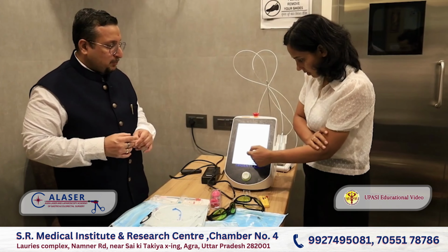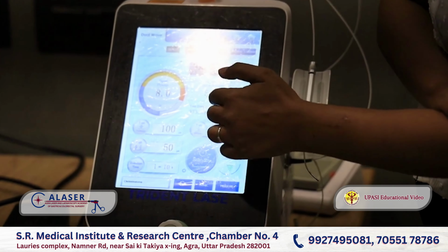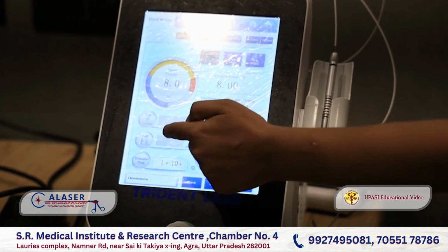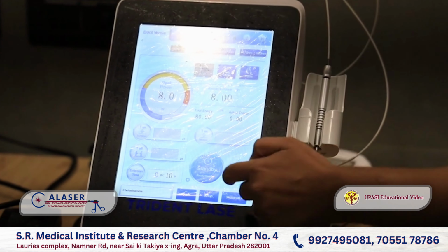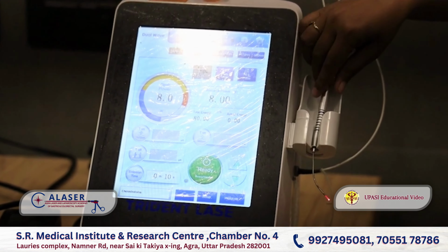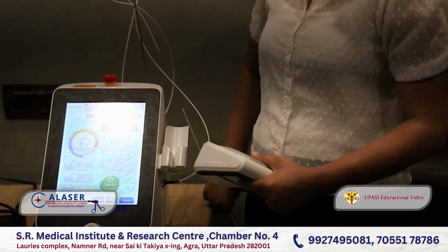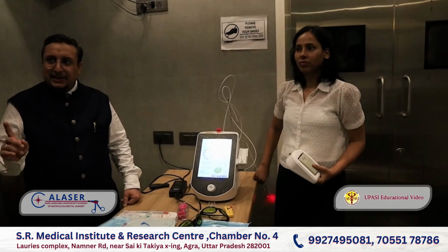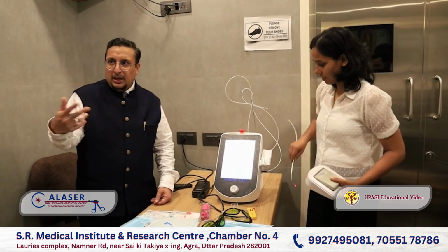So, sir, I would like to demonstrate this. Sir is telling you that you have to ask your assistant that this much energy is being delivered. So we go to the continuous mode and suppose that we want to deliver 80 joules. So you are looking at the patient and we are demonstrating, right? Your assistant has to see this actual energy. Somebody has to stand there and he has to tell you that this much energy has been delivered. I will show you in the OT how we calculate this, right?